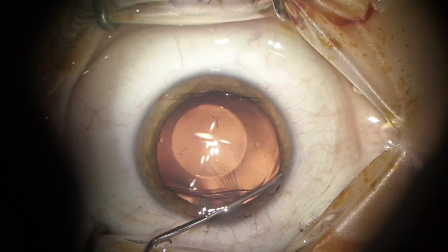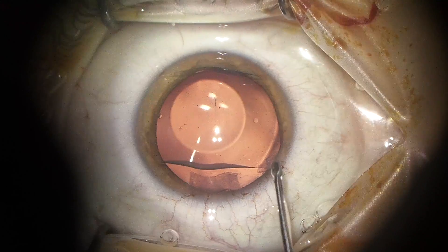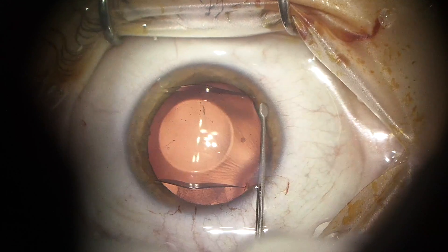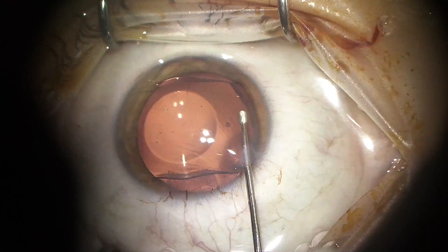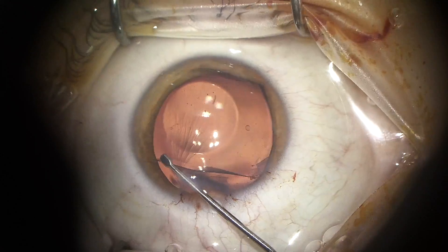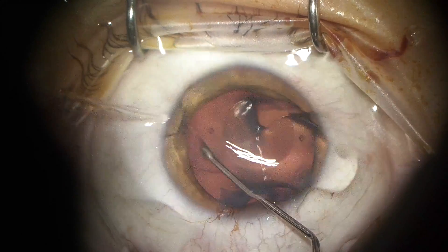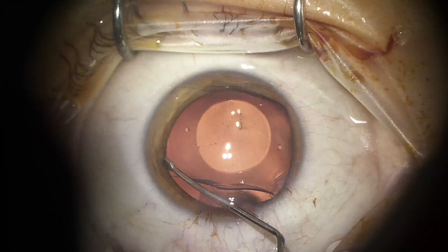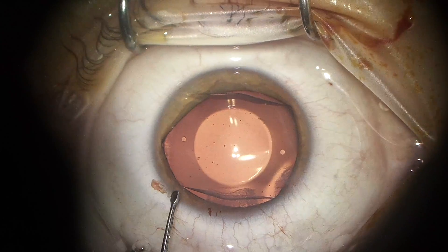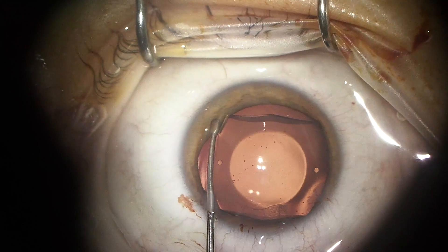This Bayer manipulator is named after a well-known ophthalmologist in the Dominican Republic who developed this device. It's flattened at the tip to allow ease of working with the footplates of the lens. The footplates will allow the lens to sit right behind the iris. I take the manipulator and push and pull, gently tucking each footplate right behind the iris as gently as possible.